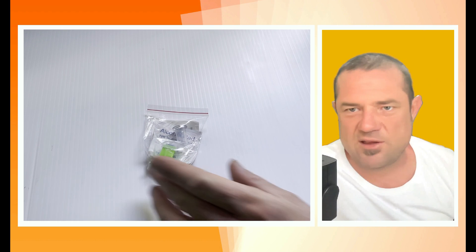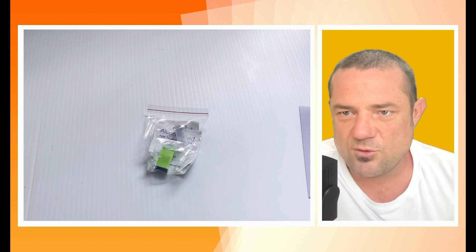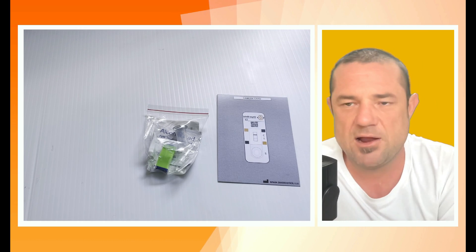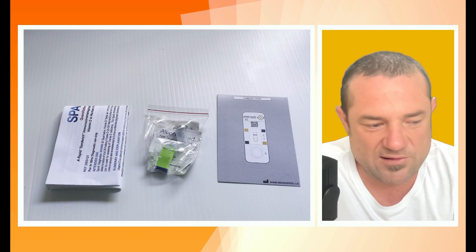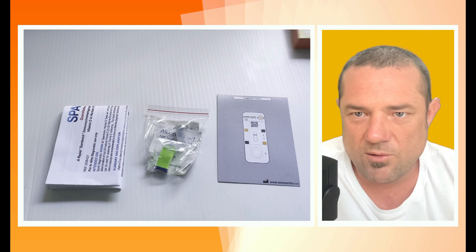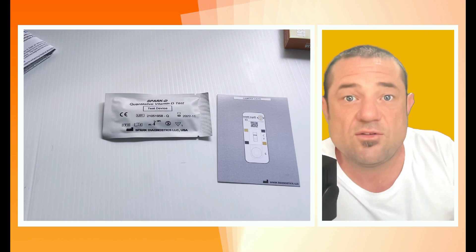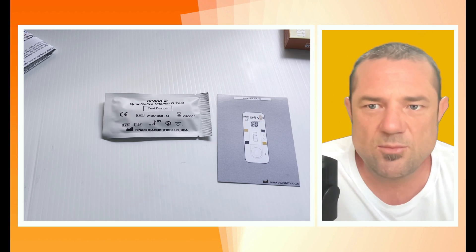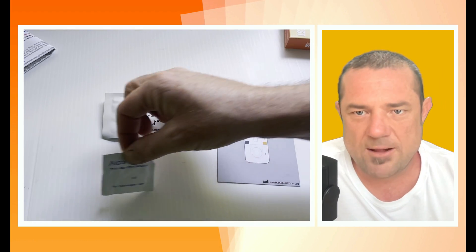Everyone loves a do-it-yourself kit, whether it's a puzzle or a vitamin D test. Inside the packet is a full set of tools. There's the camera card that the test cassette is placed on top of, some instructions — and it is advisable to read them, you don't want to waste your investment — and the test cassette itself, kept in a nice tidy aluminium foil packet until you need it.